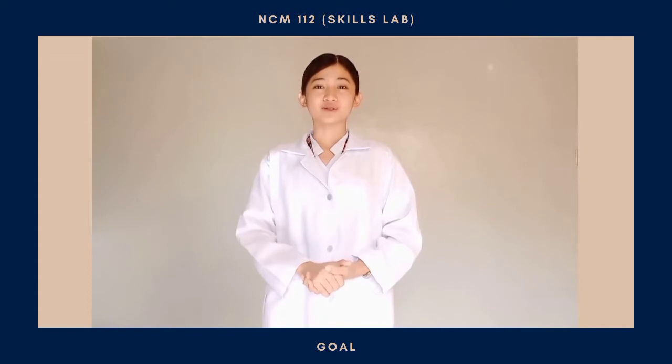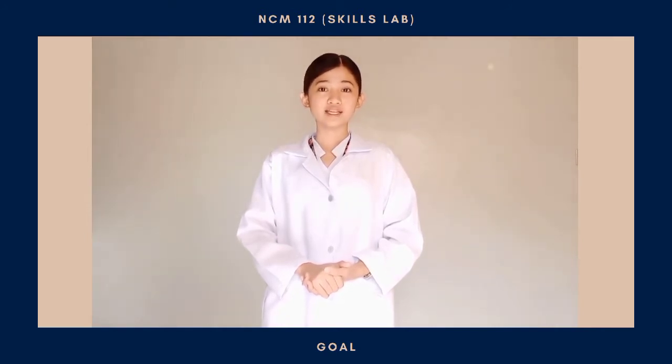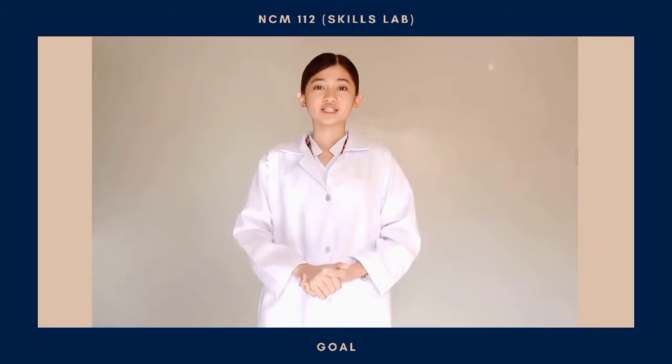Good day, I'm Hanz Nicole from BSN-3D, and today I will be demonstrating a procedure on how to provide tracheostomy care. The goal of this procedure is for the patient to exhibit a tracheostomy tube and site free from drainage, secretions, and skin irritation or breakdowns.